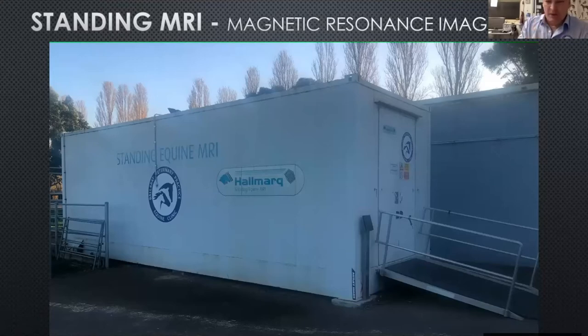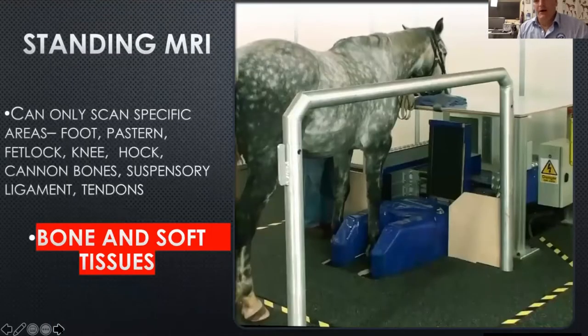The horses just walk up the ramp on the right-hand side. The doors open up. It's air-conditioned and controlled — the equipment inside has to be kept at the right temperature and humidity — so the doors are open, the horse walks in, and then the doors are shut. It's remarkable how compliant the horses are in such a small area. We've had 18-hand warmblood stallions in there, and under the right sedation techniques, really good results with both front and hind legs.